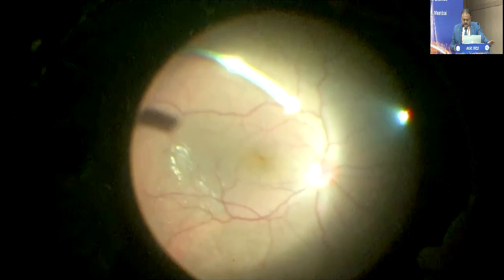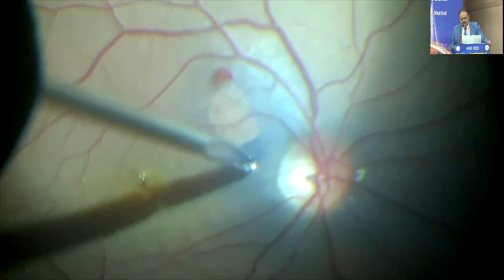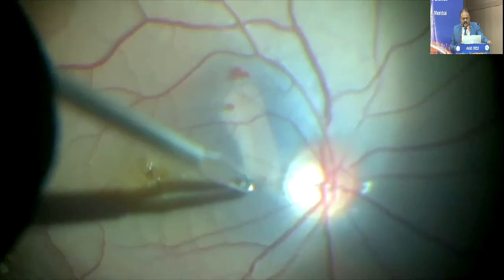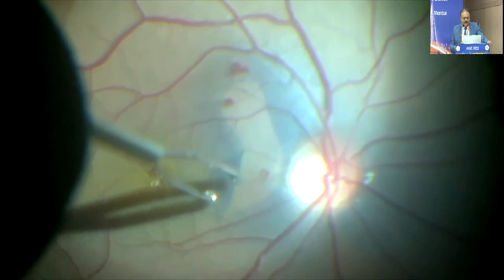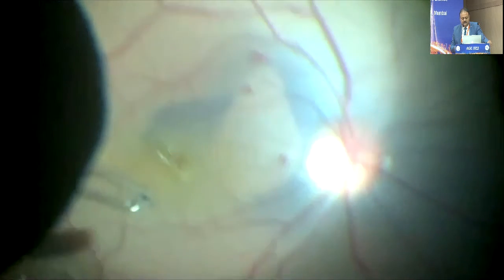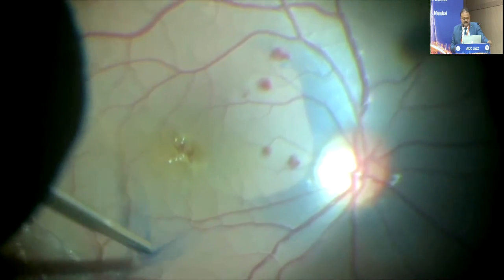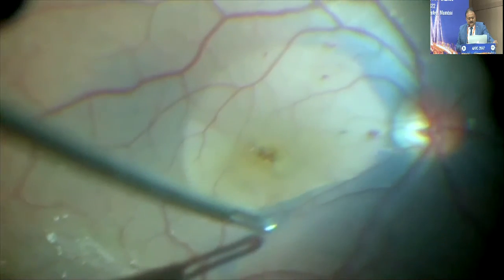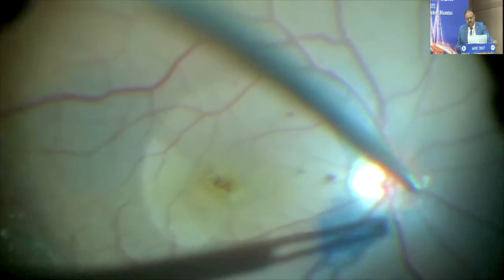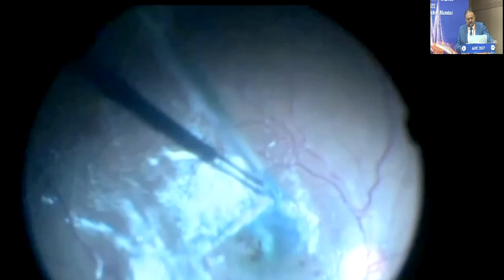In a simple macular hole, we just do a vitrectomy. What is important is we need to do a very good staining with the BBG, and obviously the visibility is very important. And nowadays with this viewing system, especially the ReSight as well as the BIOM and the high magnification lens, we can pretty well make out the ILM. So when we are peeling, it's better to peel as much as possible, because whenever there is a recurrence, we need to re-peel. So why not in the first go?